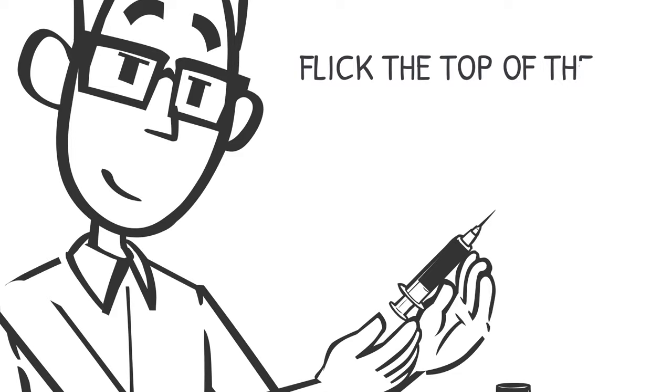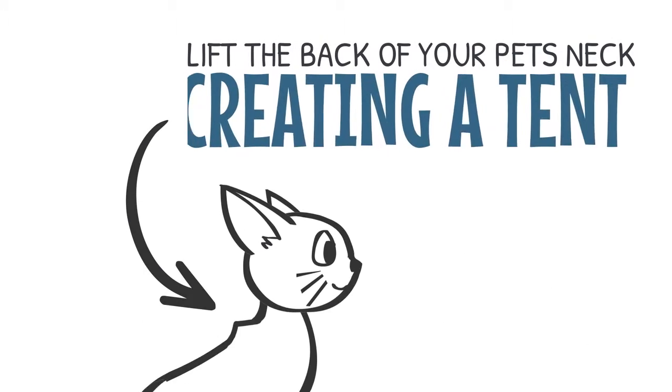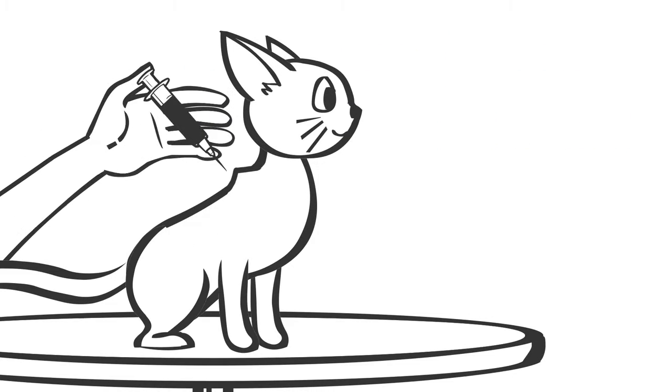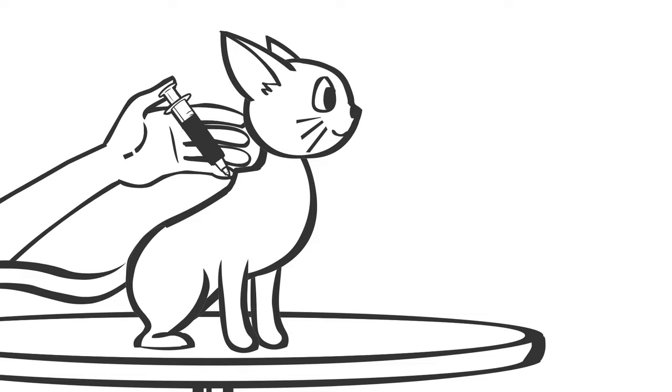If bubbles appear, flick the top of the syringe. Lift the back of your pet's neck, creating a tent. With your other hand, insert the needle at the tent's base, just below the skin's surface.